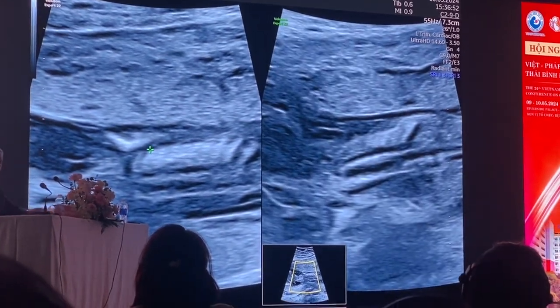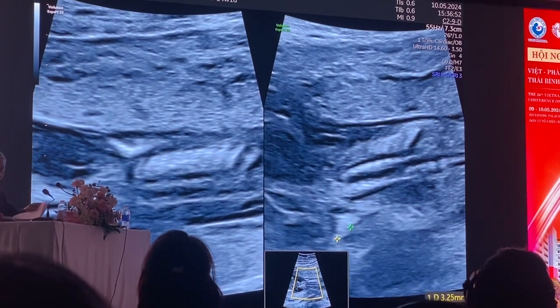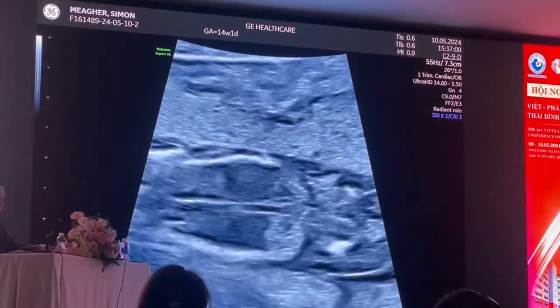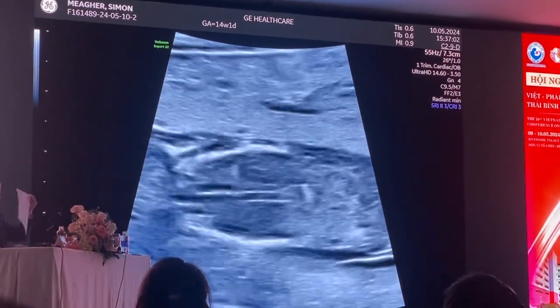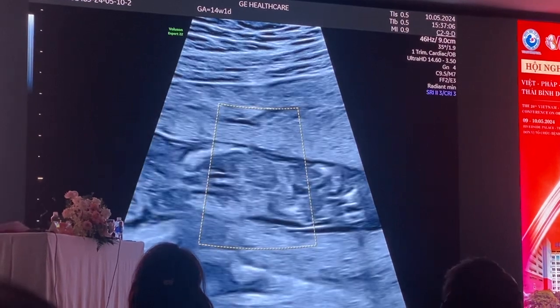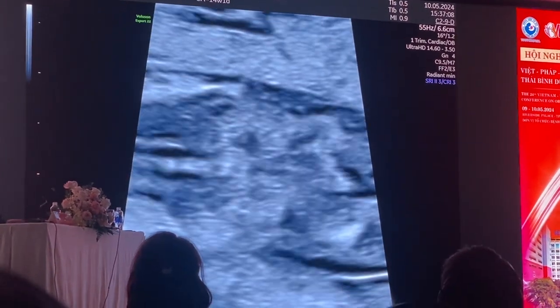And this is the scapula on the opposite side. So both scapulae are present. When I come across to looking at the ribs, I always increase my dynamic range. I want to look at the kidneys, see if there's any renal tract abnormality. As I come across to both kidneys, I can see the kidneys are quite hyperechoic.